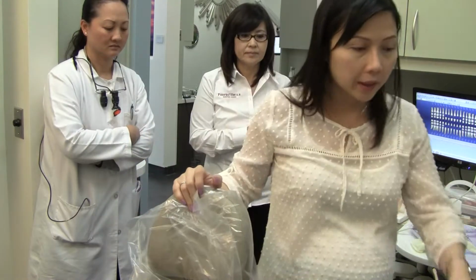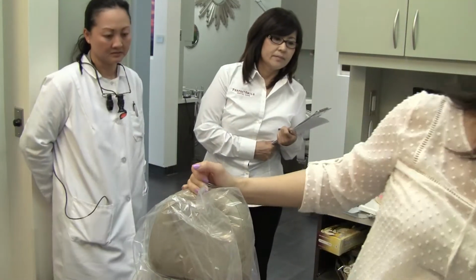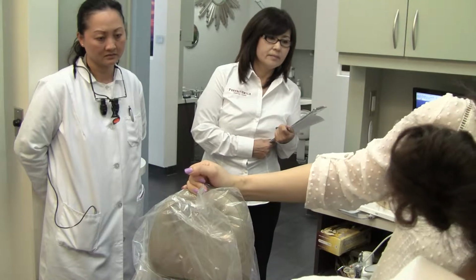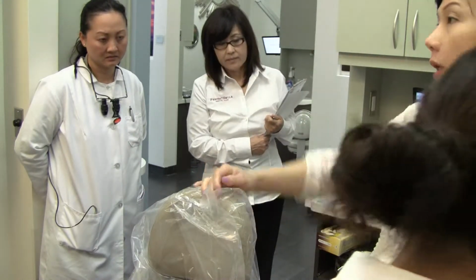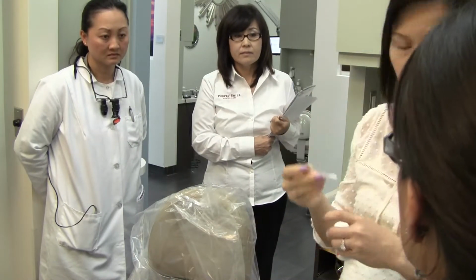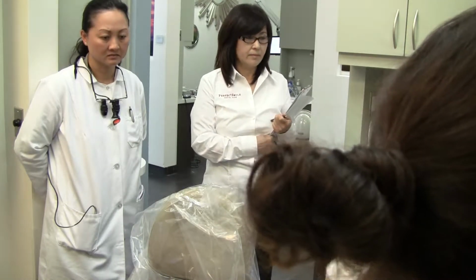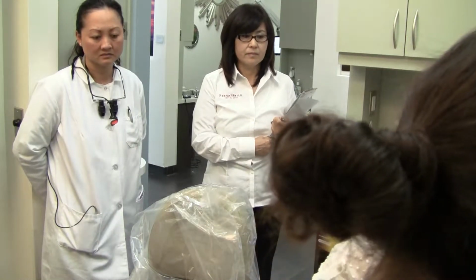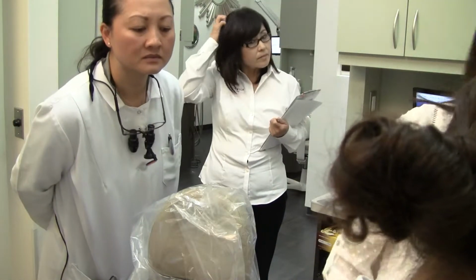So in here, we have, may I see the drawer? Topical, so we just grab that right away. Let's say the assistant is running to the back to set up. You can just grab this and put it on right away. And then here too, you just grab one of each. This is not loose, so you should have a loose syringe here.